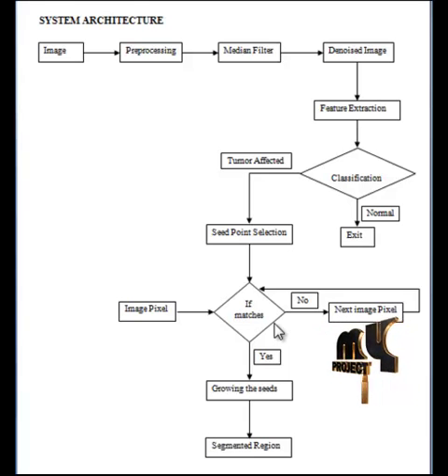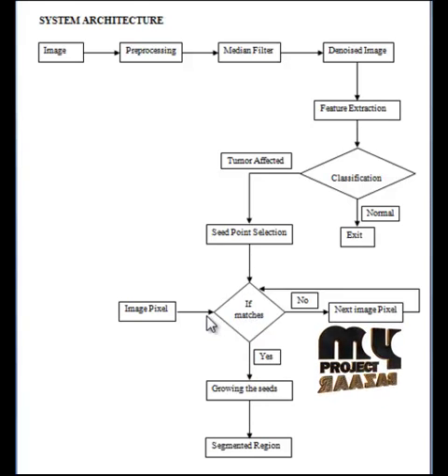At each stage for each region, we check if there are unclassified pixels in the 8 neighborhood of the region border pixels. Before classifying, the region homogeneity is verified. The two regions are merged on the basis of the arithmetic mean and the standard deviation. By comparing the values to the seed points, the values are matched, and if the values come under the threshold, then the regions are combined. Thus, the single selected regions are grown in order to get the overall tumor affected regions.